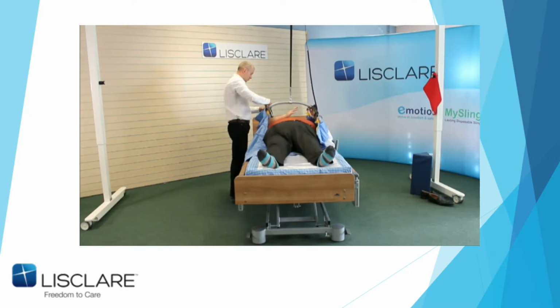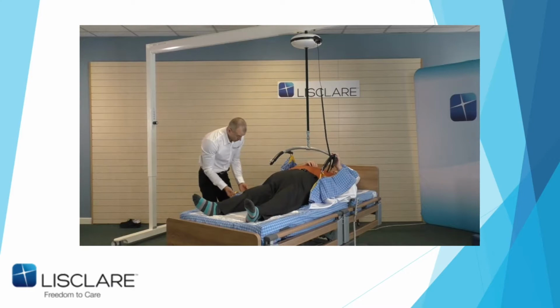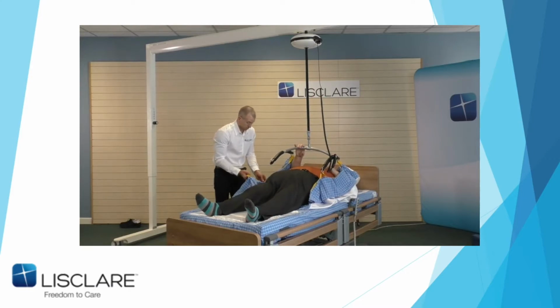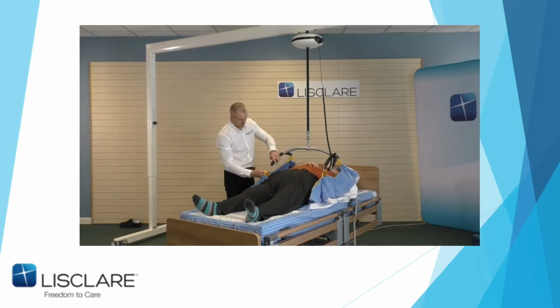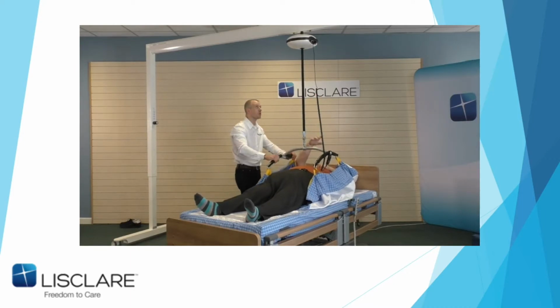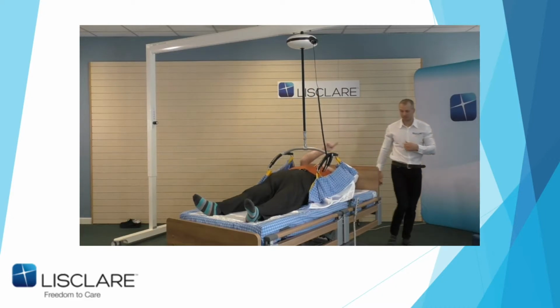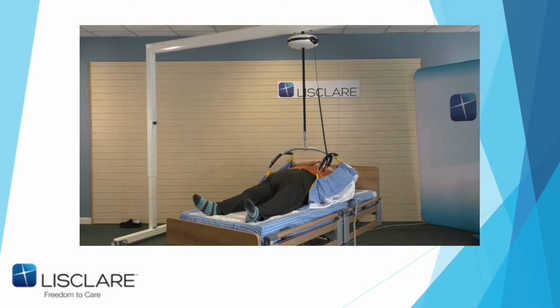Unfortunately, in this case, we have a gantry. And it's just a straight gantry. So I'm going to show you why I so like the casters on the gantry. One of the reasons, obviously, is if that's the exit point to the room, and you've done your lift, the gantry can be moved. So John's just going to move the gantry slightly up above me. John, if you move that left-hand side up, and put the brakes on.